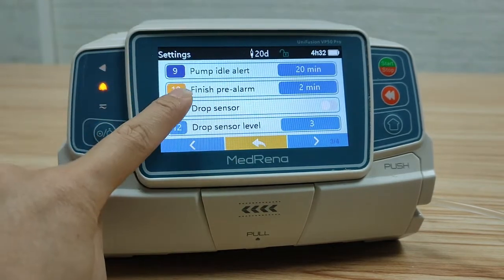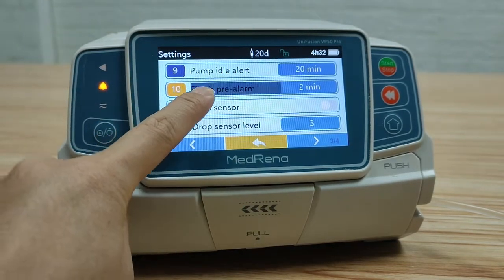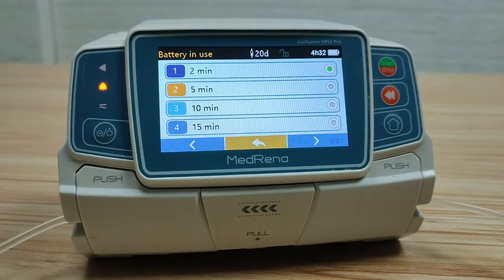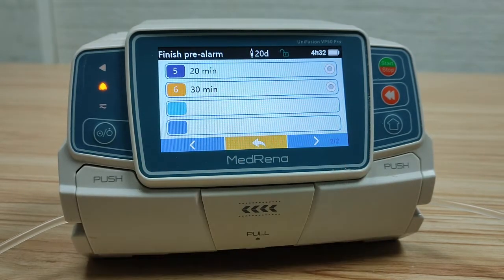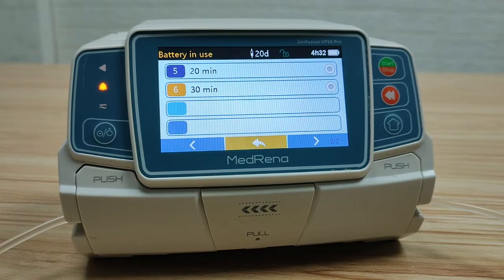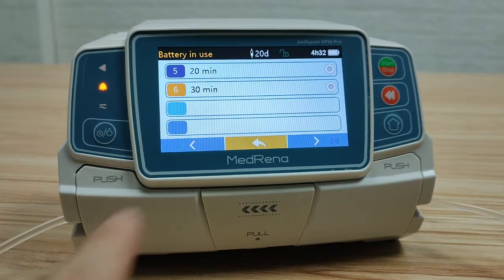Finish pre-alarm: choose the amount of time before the infusion is about to finish that the pump gives an alarm.